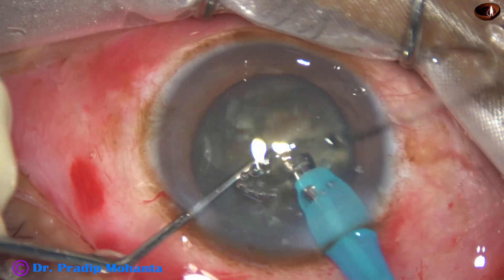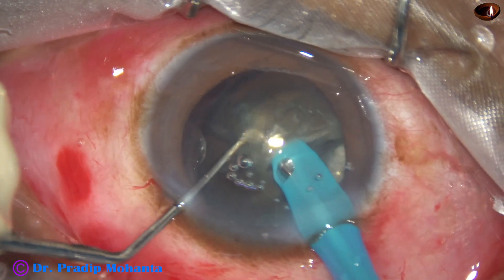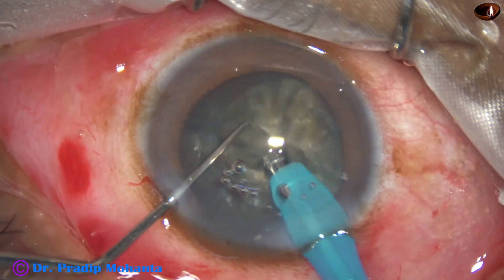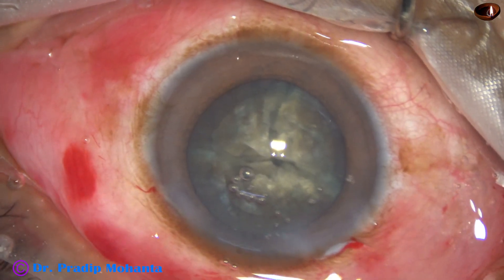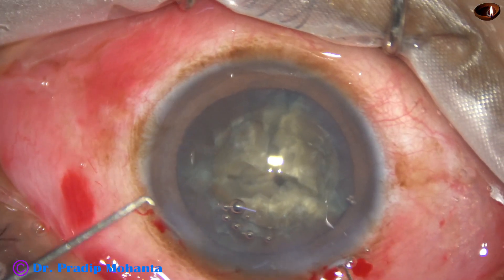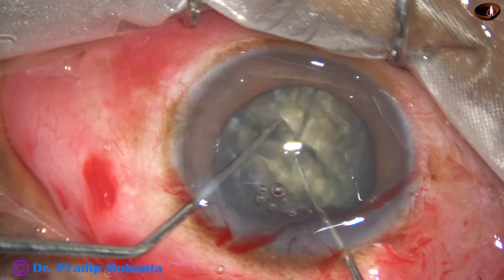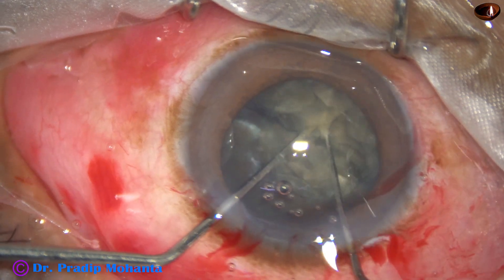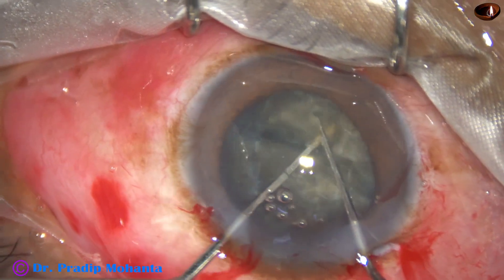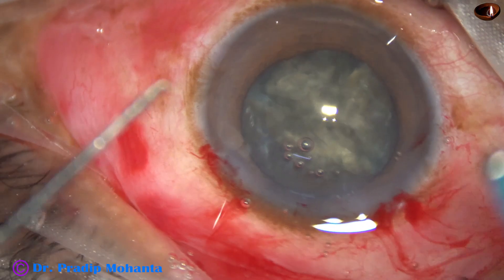Now I am going to divide this hemi-nucleus — go to the belly of the inner edge and divide it. I came out and inject visco. The two fragments are not free; there is a band joining them. So I go behind the band, and with another Sinski hook I address another band. When the two bands are torn, the two nuclear pieces are free.